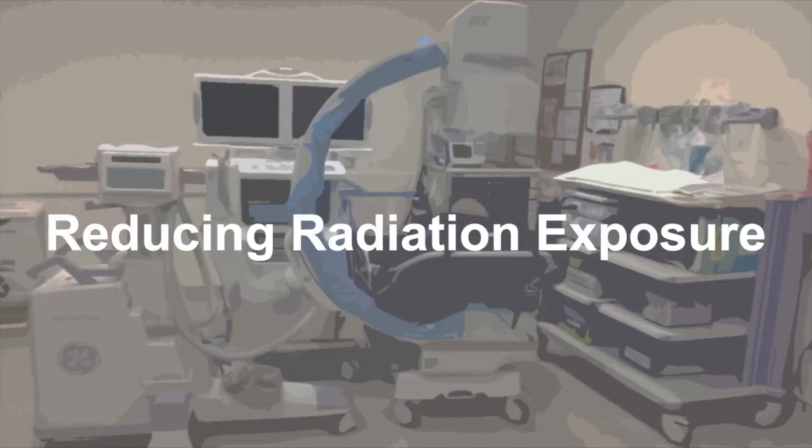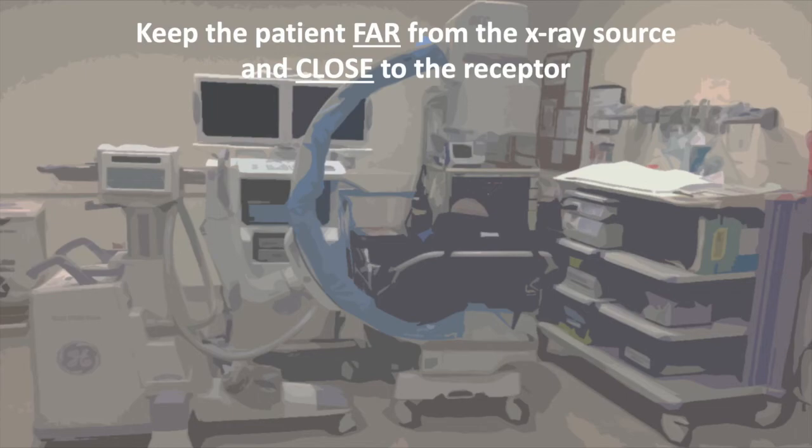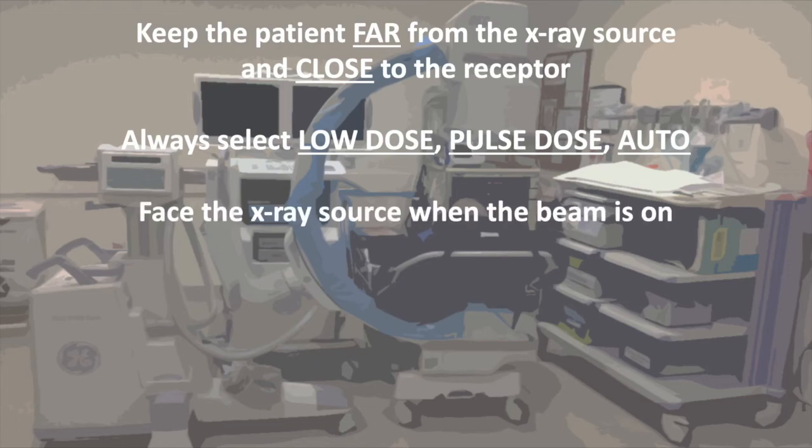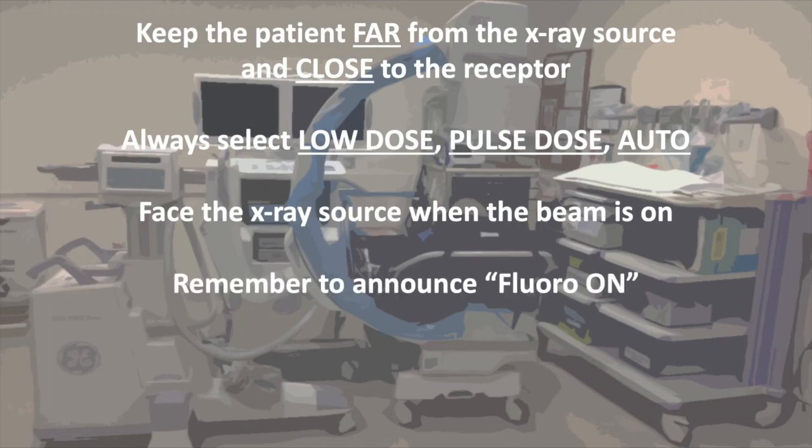In this video, we have reviewed several ways you can minimize radiation exposure for your patients, yourself, and others in the bronch suite. Remember, the patient should be at least 30 centimeters from the X-ray source and as close to the receptor as possible. The fluoroscope should be set to low dose, pulse dose, and automatic exposure mode. Ensure all staff know to face the X-ray source when the beam is on and remember, loudly announce fluoro on every time you use the fluoro beam. Most importantly, minimizing the time your foot stays on the pedal is the biggest way to reduce radiation exposure for both your patient and yourself.